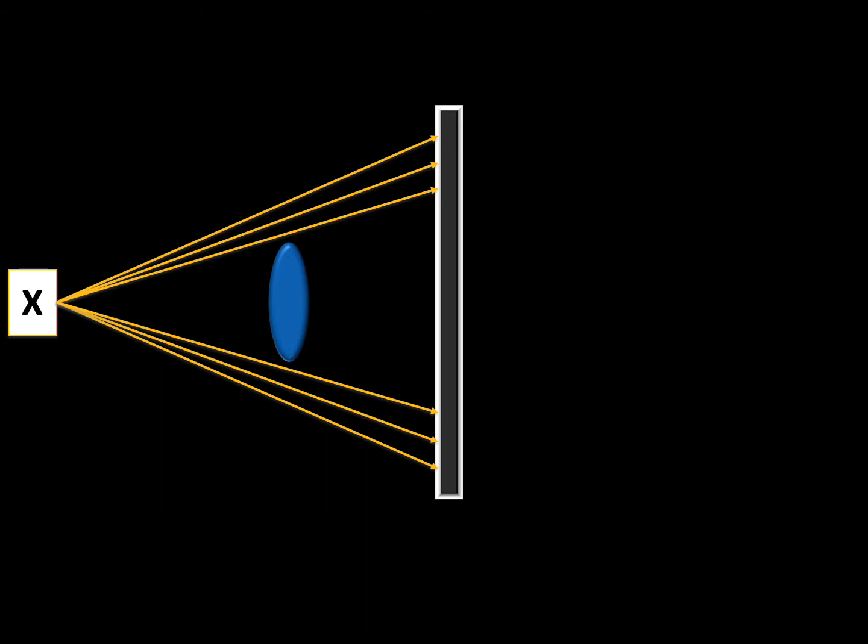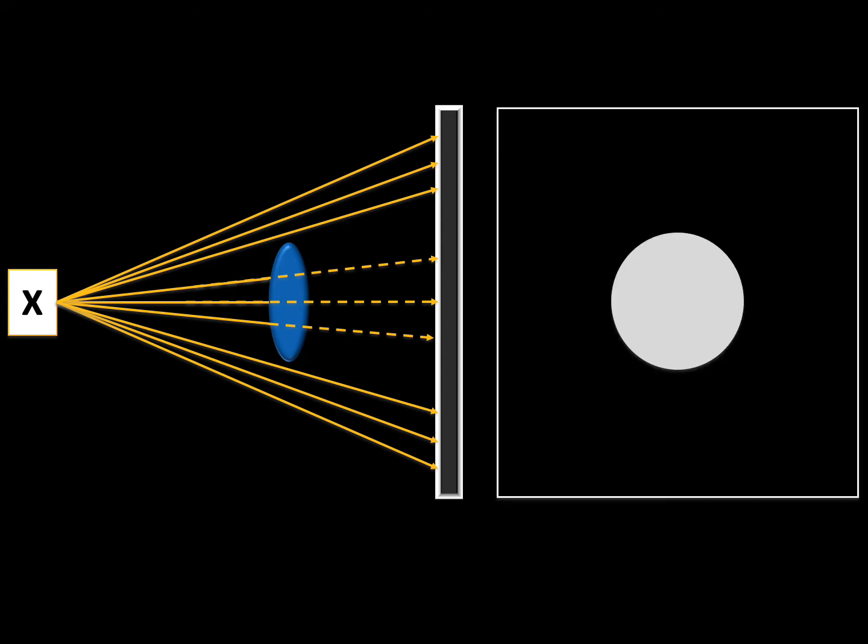comes. Imagine another scenario wherein you keep an object or you place a patient in front of the X-ray tube so that when you switch on the X-rays, those that pass on either side of the object will result in complete blackening of the film, whereas there will be a certain set of X-rays which will pass through the object or through the patient, and these X-rays will be partially absorbed. So this results in reduction in the intensities of the X-rays.